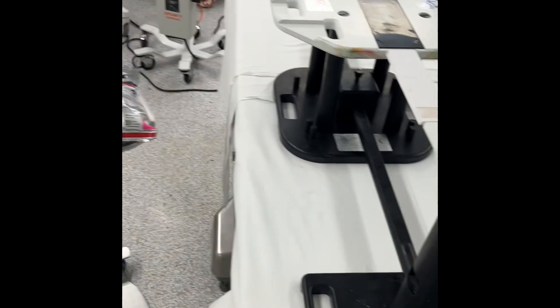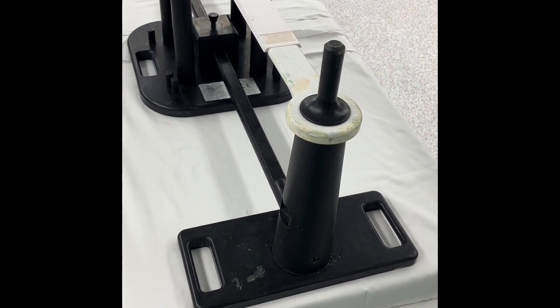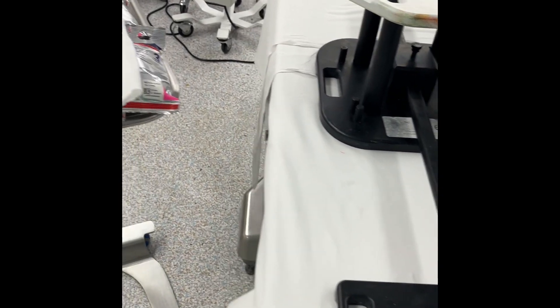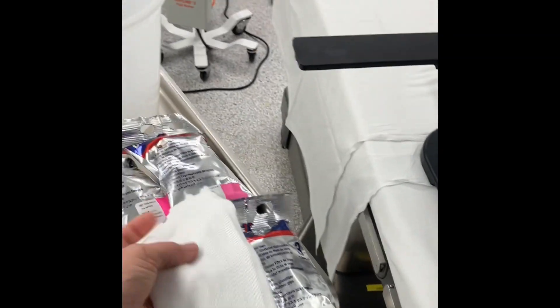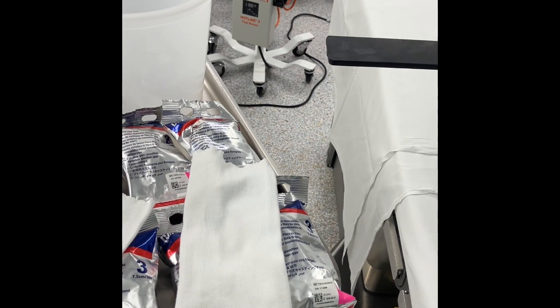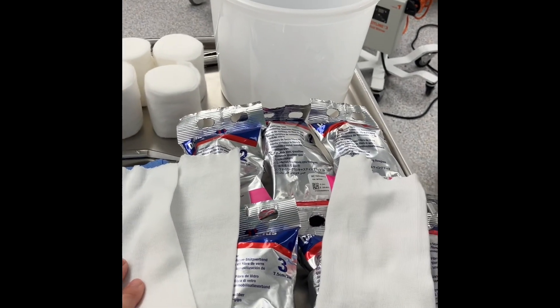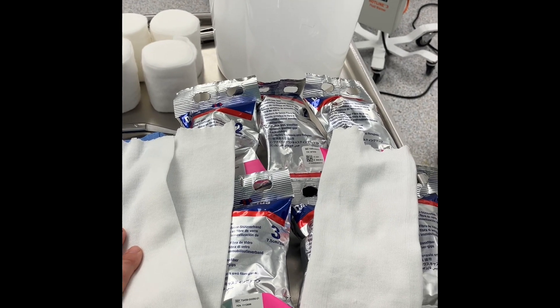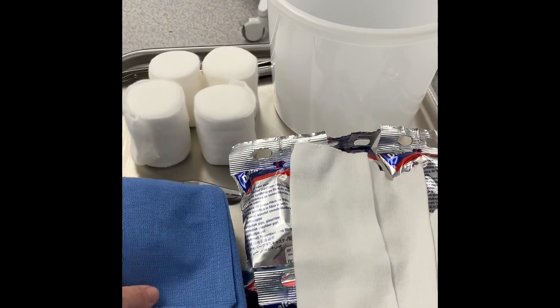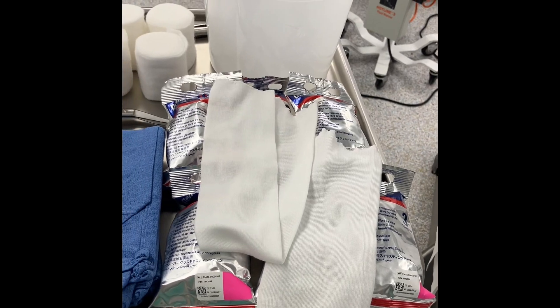Now that we've got our bed ready and all of our supplies ready, it's time to put the spica cast on the patient. As a scrub tech, you will be holding each leg here at the end of the bed while the doctor puts the cast on. The first thing they will do is put this four-inch stockinette through both legs and all the way up to the waist of the patient. If they're doing just one leg, they will use this three-inch — and I cut it really long because they can cut it shorter later. If we're doing bilateral legs, make sure you have two of these. It's also important to have towels, because they will put towels on the patient's abdomen and then put the cast on so that we don't over-tighten the cast and the patient has trouble breathing.